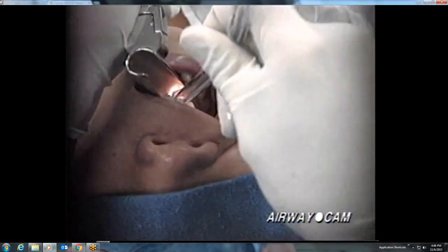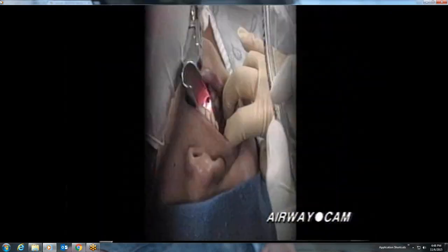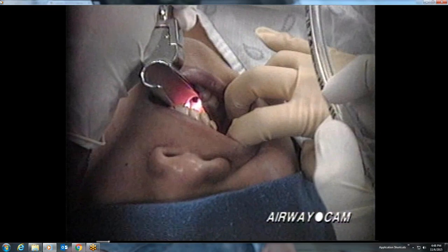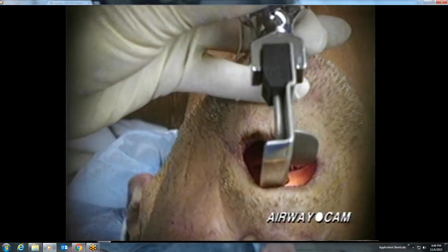Lip retraction provides improved visualization down the right side of the mouth. Notice the round, almost tubular appearance of the flange of the Wisconsin blade in this still shot. The Miller blade has a much smaller flange. In an emergency situation, such as with massive tongue swelling, an endotracheal tube can be placed directly down the large barrel of the Wisconsin blade, although tube passage from the right side in order not to block the line of sight is recommended. This next laryngoscopy is with a modified McIntosh blade.